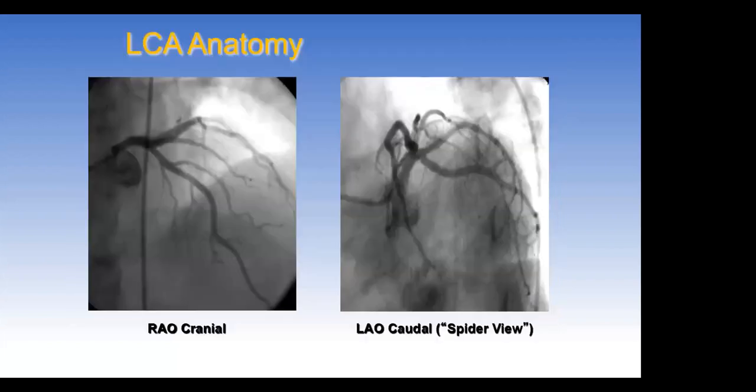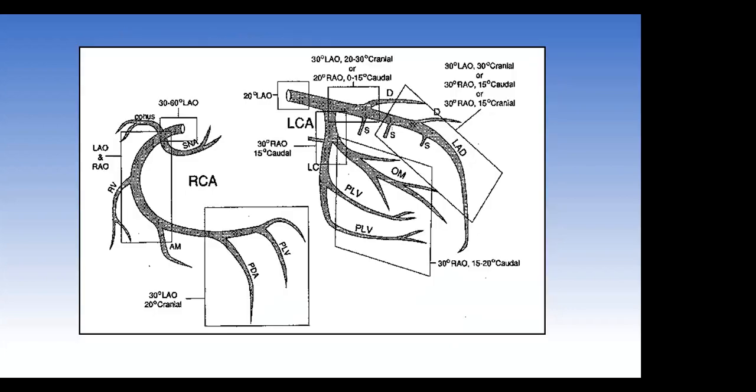For those who don't see the coronary angiogram all the time, this is what we see. On the left side, there is an RAO view of the left coronary artery. And on the right side is an LAO caudal view of exactly the same artery, which looks so much different. So we're using multiple projections and views in coronary angiogram to delineate each part of the vessel, to best visualize the segment, so-called open the stenosis, and identify the worst possible view.